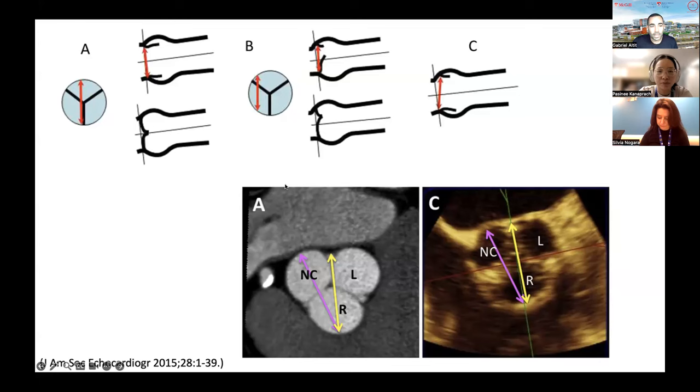Yeah. The other thing that's important is, again, alignment. You remember how I told you that the aortic valve is typically trileaflet? Well, the way you cut it, depending on where you are in 2D, you can see that it's very different. So first of all, it's not a perfect circle, right? It looks like a flower, almost like a triangle. So it's not a perfect circle.